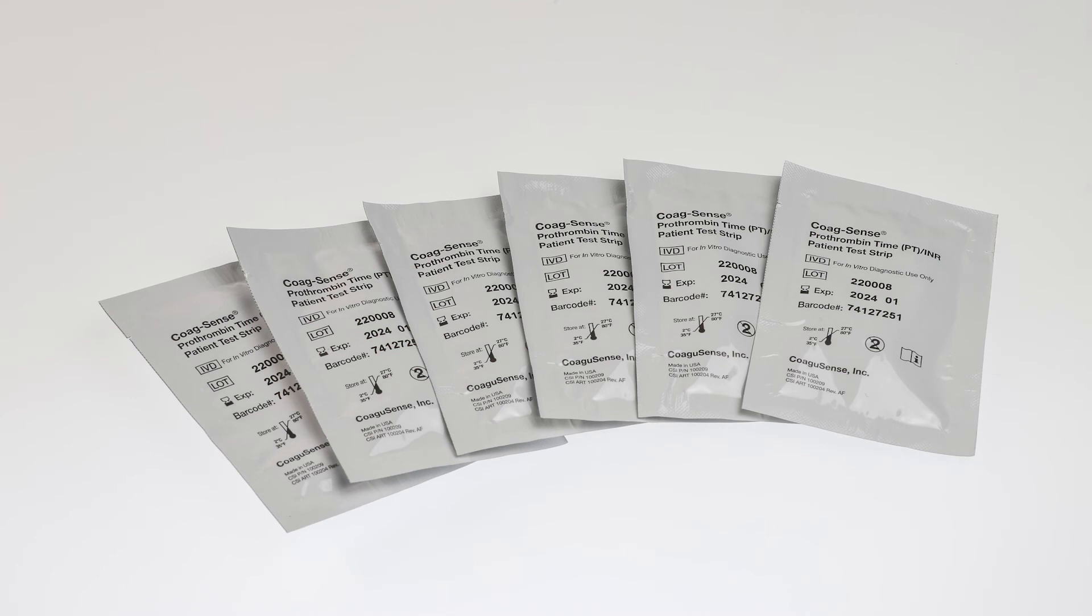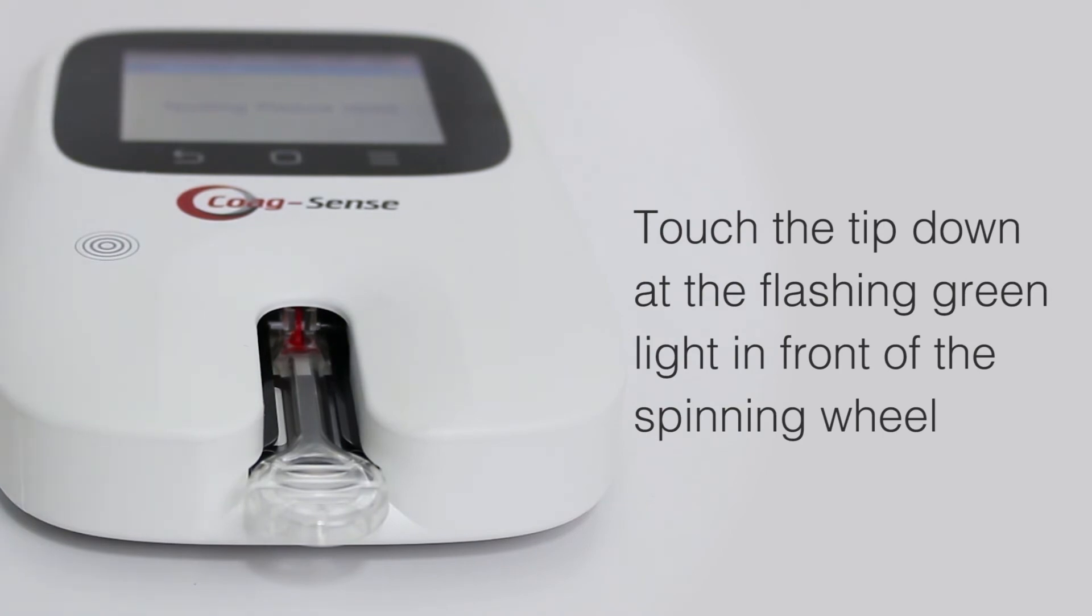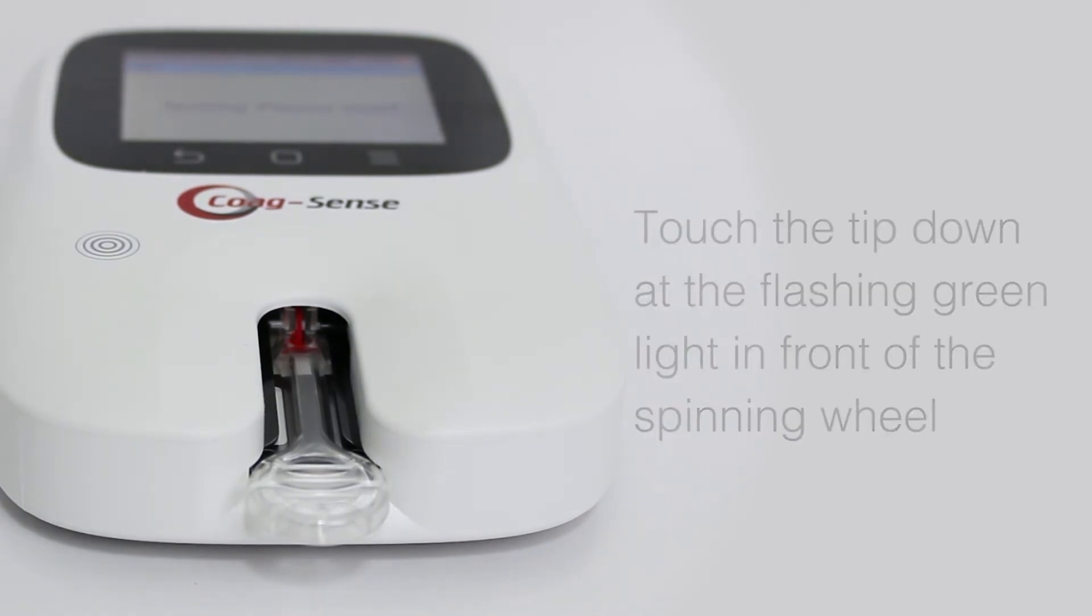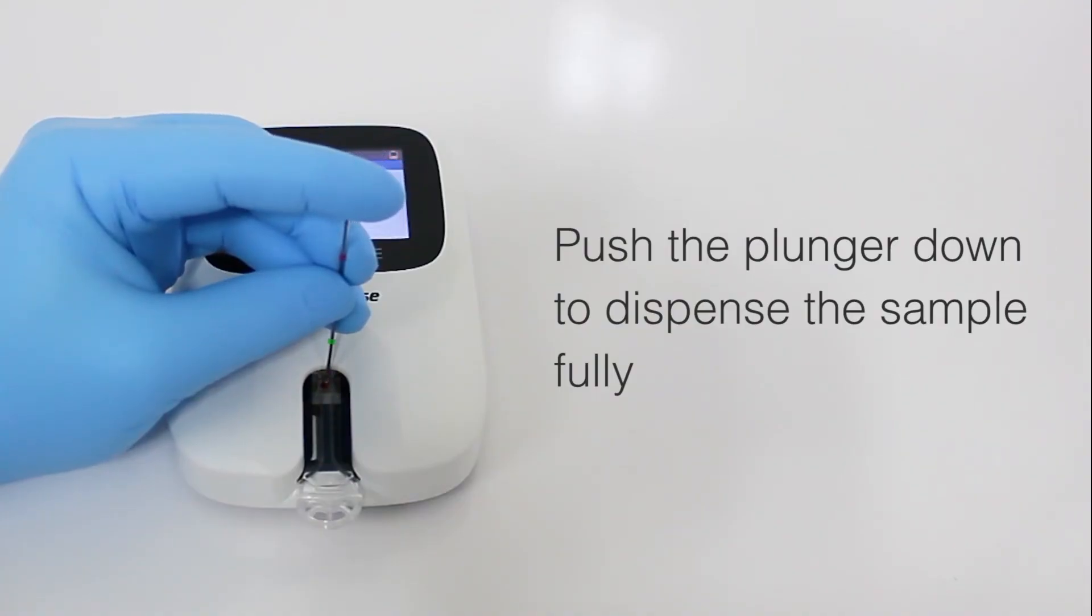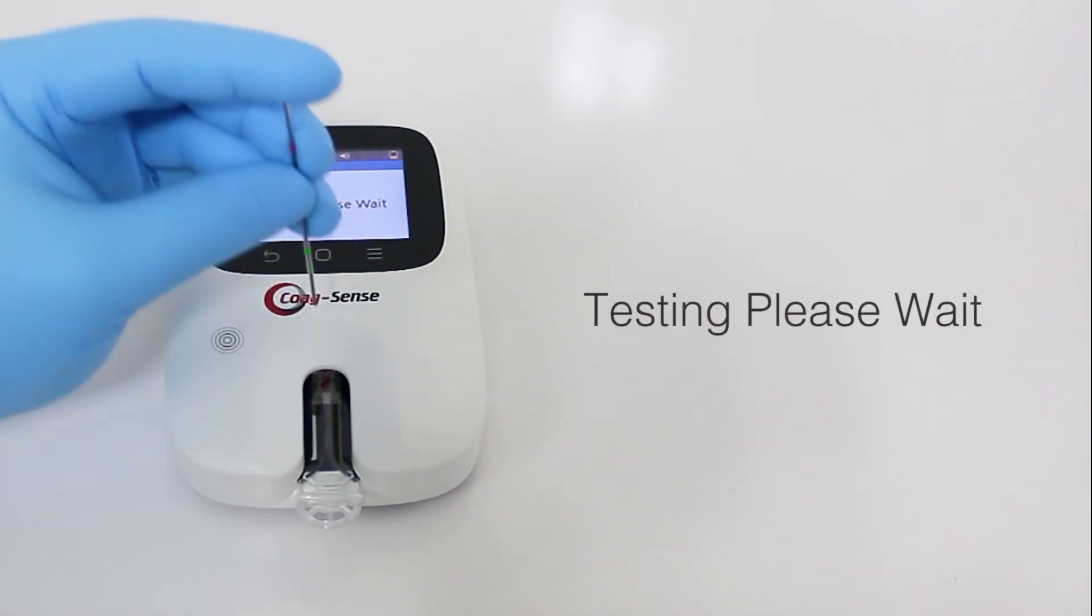Test strips are packaged individually so that all strips are equally fresh. Just a 10 to 12 microliter drop of blood applied to the test strip using a transfer tube ensures an accurate sample, reduces errors, waste, and contamination.